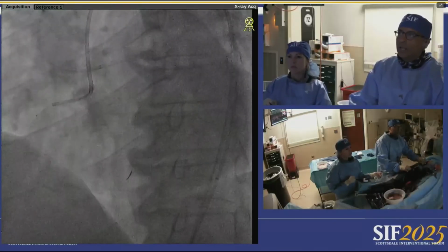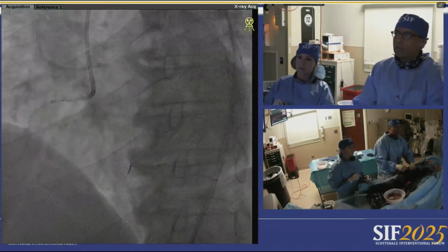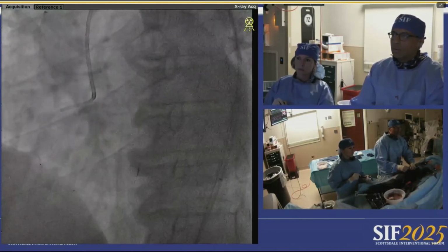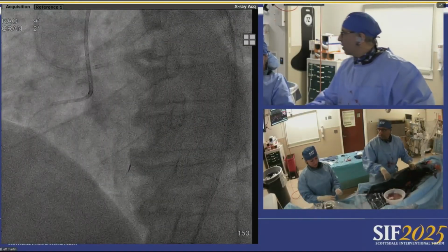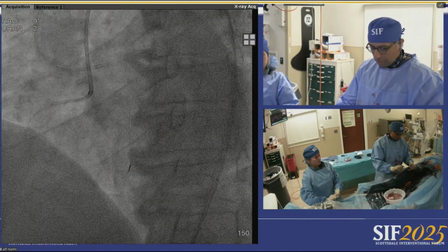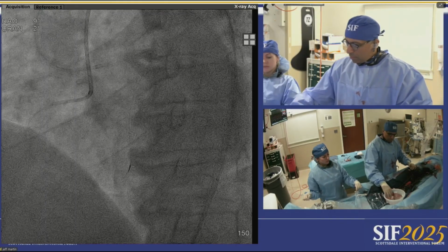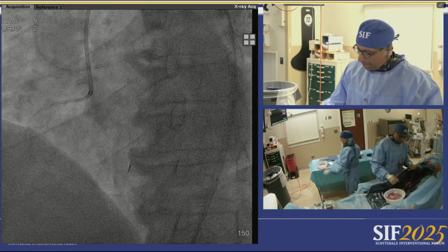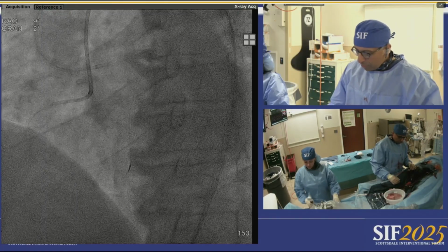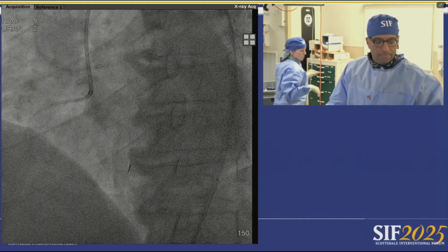Mike, we don't have great therapy for eccentric calcium, and you can sometimes be limited on the compliance of the architecture of the vessel. What advice do you give people on how far is too far when we're dealing with eccentric calcium? Well, as my main mentor, Dr. Kern, says, the way to limit your mistakes is to stop one step before you make it.